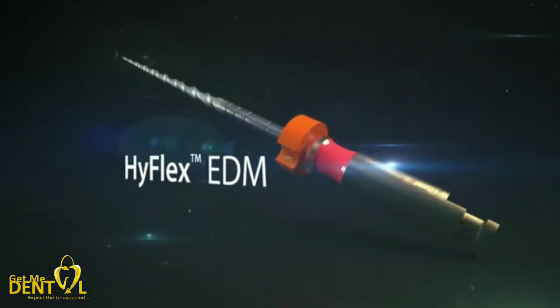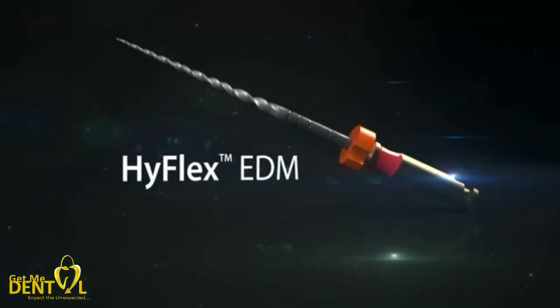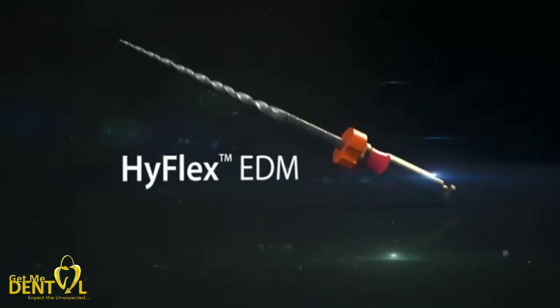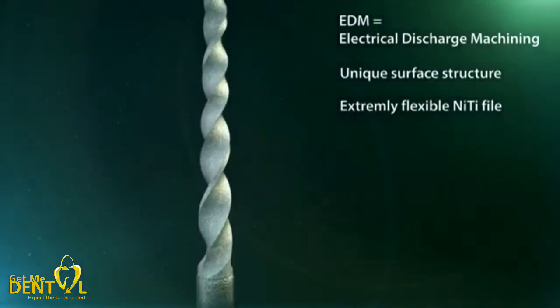The outstanding qualities of the modern endodontic instruments and working aids are their astonishing versatility and their exceptional reliability in everyday use. Thanks to a special manufacturing process, the HyFlex EDM has a unique surface structure. Spark erosion by electrical discharge machining produces an especially efficient and extremely flexible nitinide file.